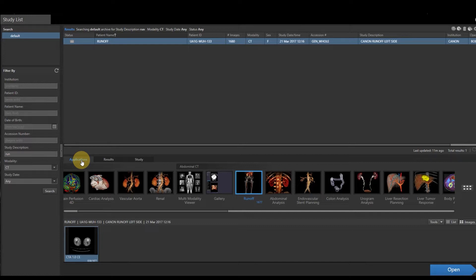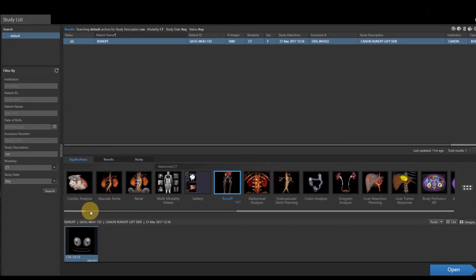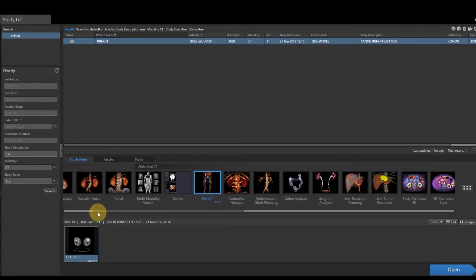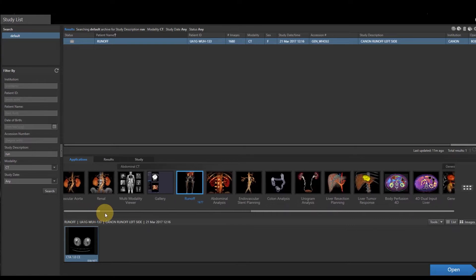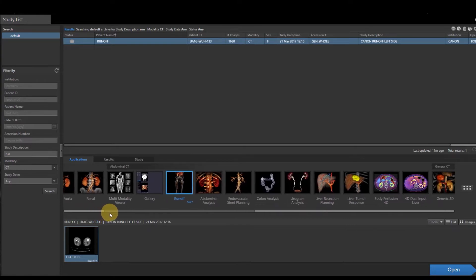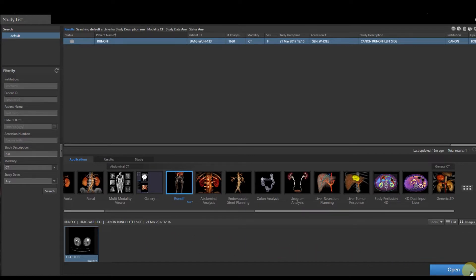We want to go through and select our runoff application. You have a slide bar directly down, so if you don't see it, just use the little slide bar until you find your runoff application. I want to select that. Directly below, you're going to have your raw data series. You want to select our thin slice images, which this is the only one that we had sent across. And then down at the bottom right, we're going to select Open.